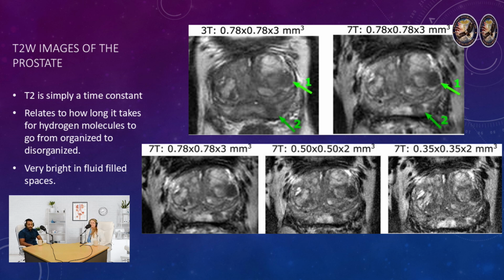I don't know if we ever get a chance to do 7 Tesla prostates, but there are not that many of those floating around. I don't know if we have any 7 Teslas in Florida. Jacksonville, I'm sure Mayo Clinic. Oh, Mayo Clinic. Great to know.